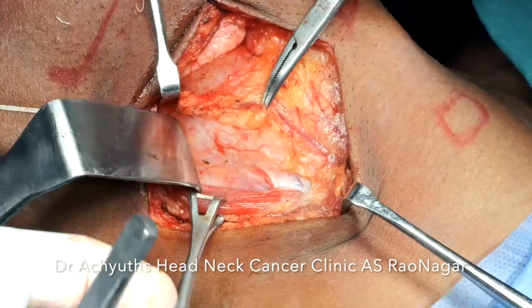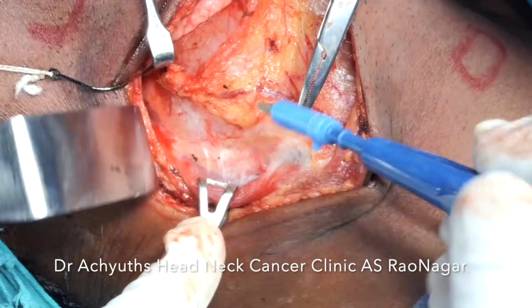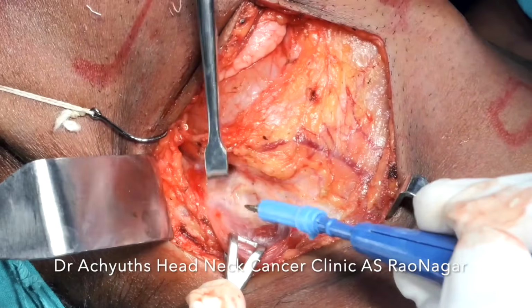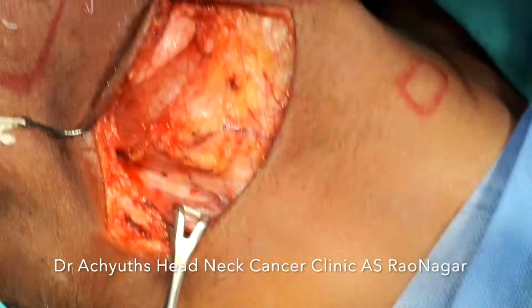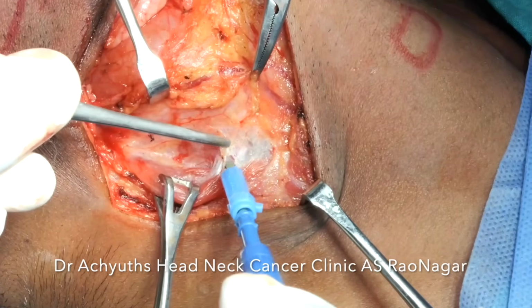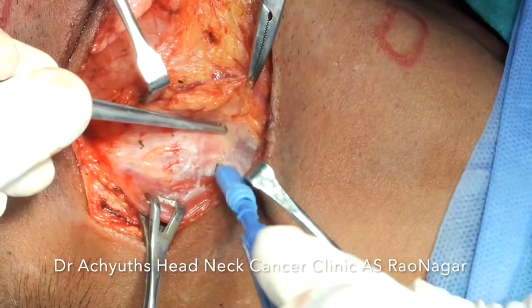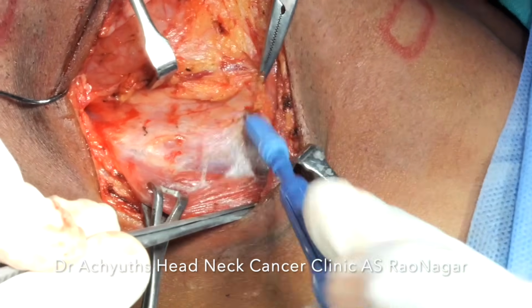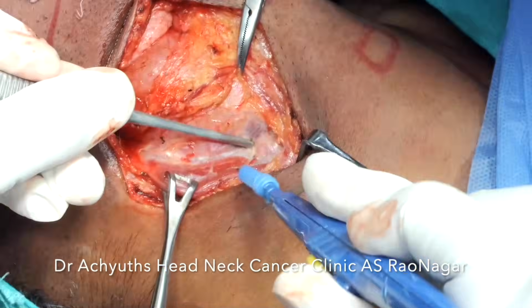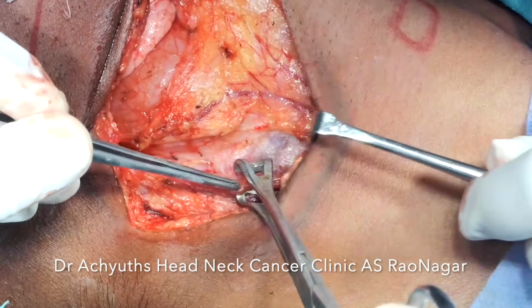So in this way, with the help of cutting current, in this case I have used a very low wattage of cutting current. It is almost on 10 to 12, and I have taken time to do cold dissection and cut the tissue rather than coagulating. Wherever it is required, I have used mosquito forceps to divide the fascial attachments. If there is any loose areolar tissue, we can actually get some space properly.